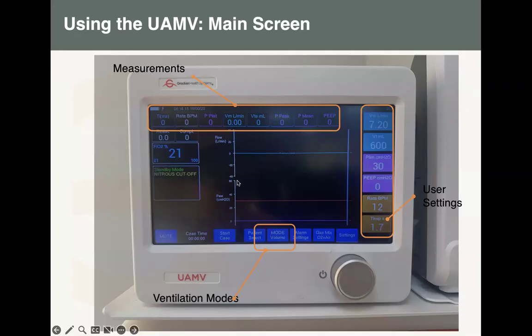But things like tidal volume, minute ventilation, pressure, mean pressure, all of those things. Remember, when someone is on anesthesia, there is some collapse of some alveoli. So things like PEEP, you have to make sure the setting is okay. Things like the IE ratio. All of these things you have to monitor to make sure the patient is safe. Next.